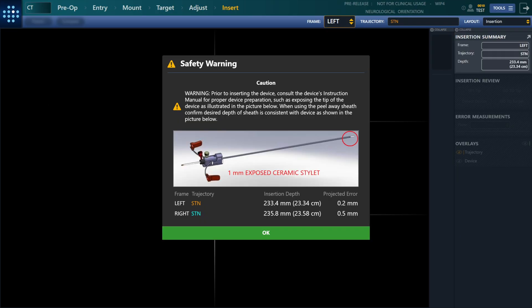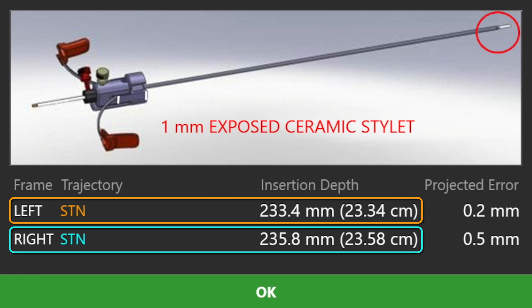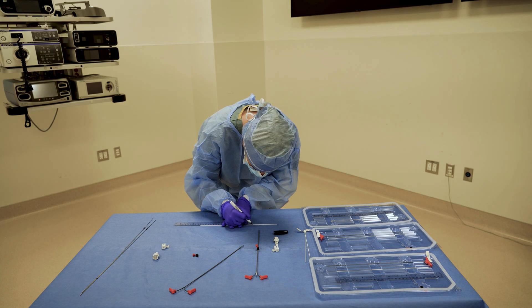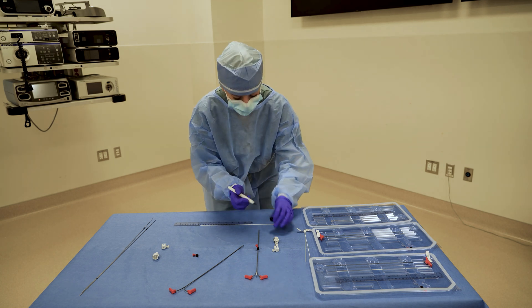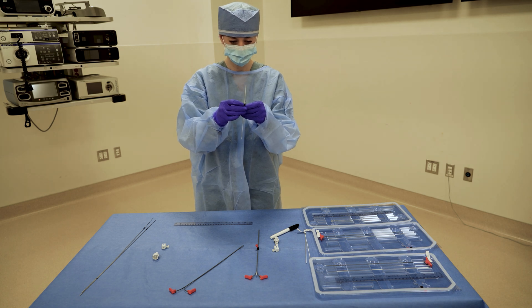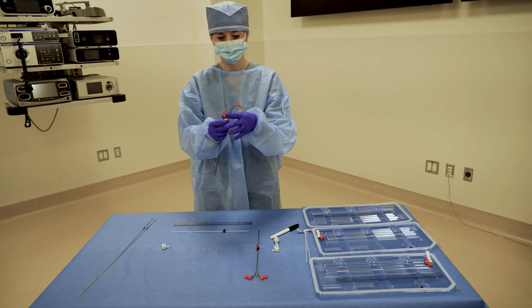The software will display insertion depths for each plan trajectory. The ceramic stylets are measured to the prescribed depth. A peel-away sheath assembly is created for each plan trajectory.